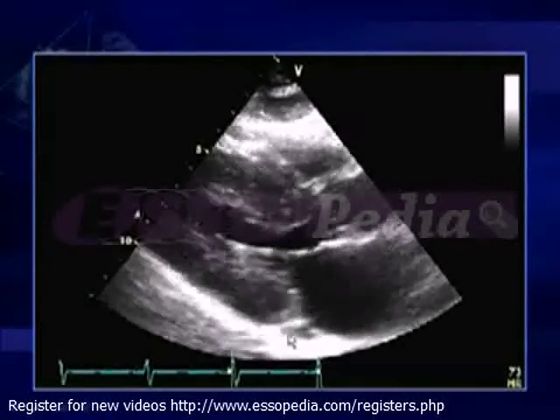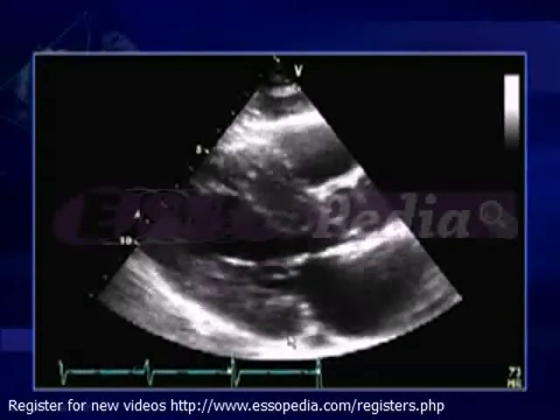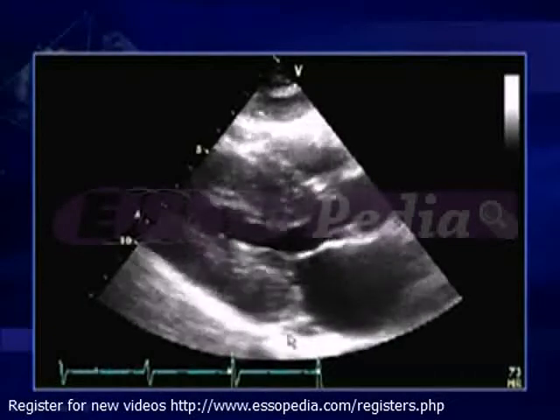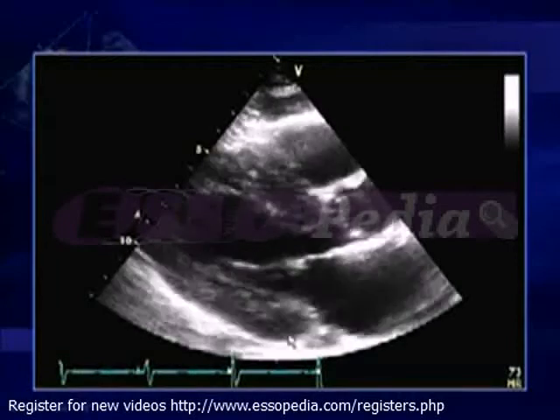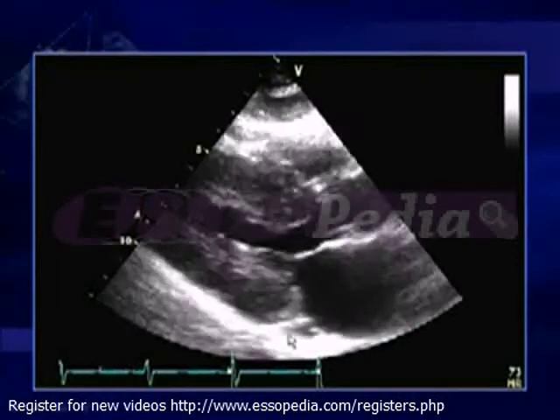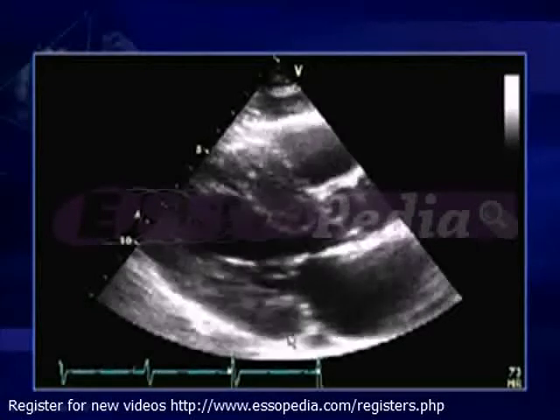Here is her parasternal long-axis view, and we are reminded that it is often the initial observations of the two-dimensional image which can provide some diagnostic clues as to the status of diastolic function.